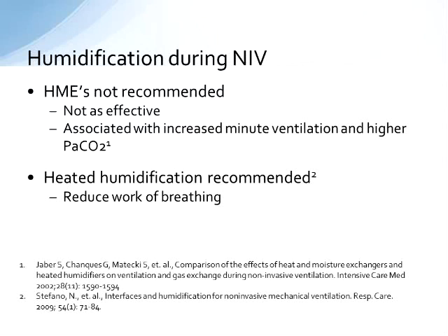And HMEs have been associated with increased minute ventilation and higher PaCO2s, really due to increased resistance to gas flow through that device. So generally, for patients, particularly in acute exacerbations, it's recommended that you use a heated system, either heated wires or a passover system. This helps to reduce the work of breathing and really is a much more effective means of providing humidification to those patients.